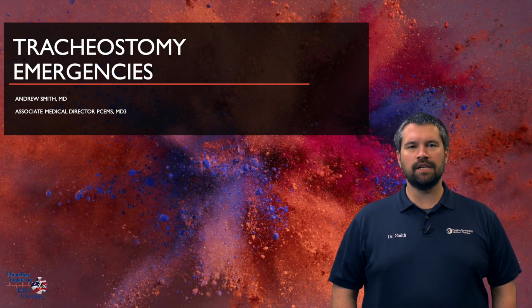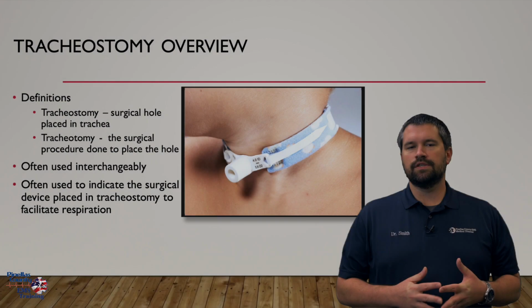Just wanted to go over tracheostomy management and care so that we can provide the best care for our patients in the field. So what is a tracheostomy?